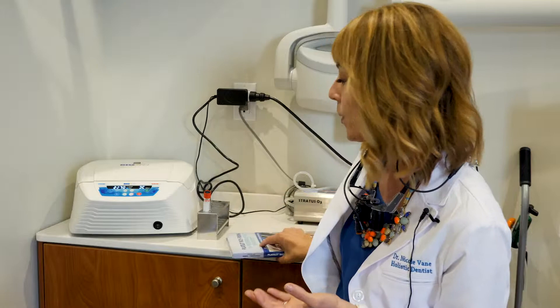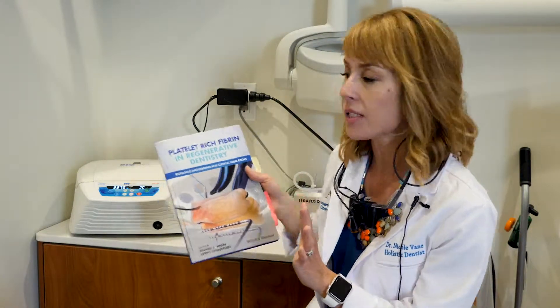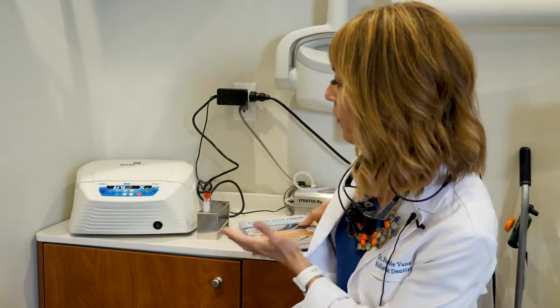Platelet-rich fibrin is where we draw your blood and we spin it down. I use a horizontal centrifuge, and it separates into your red blood cells down at the bottom, and then we get this beautiful gummy bear-like plug of platelet-rich fibrin. I've trained under Chacruin, Picos, and most recently under Dr. Rick Miron, who wrote this textbook and designed the centrifuge.